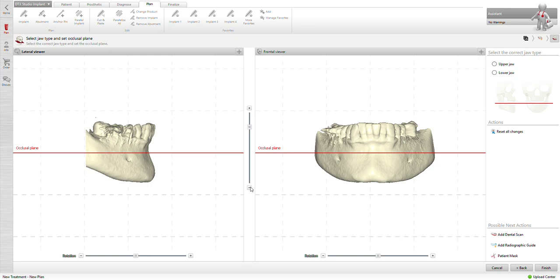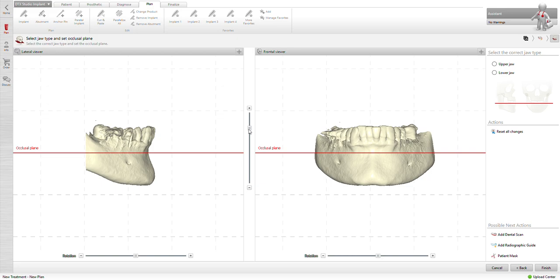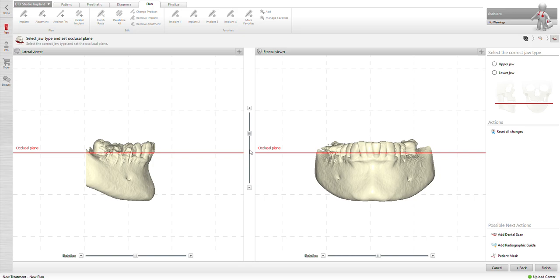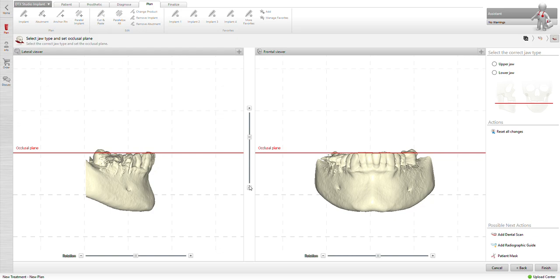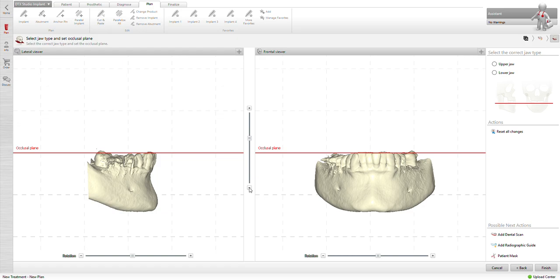I'll go ahead and reduce what we don't need. Next. Alright, go ahead and set my occlusal plane.